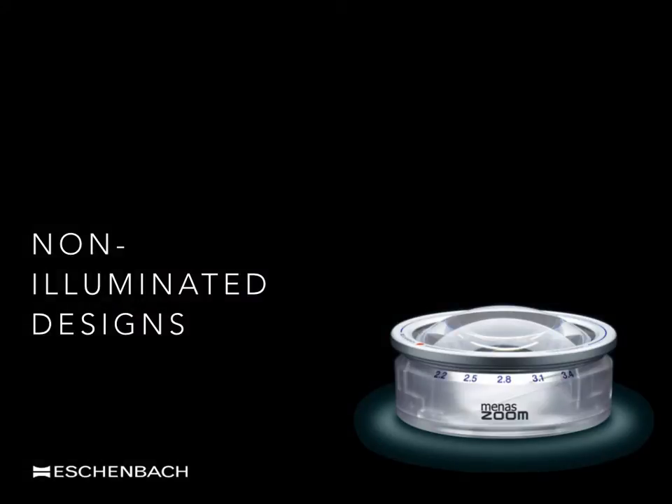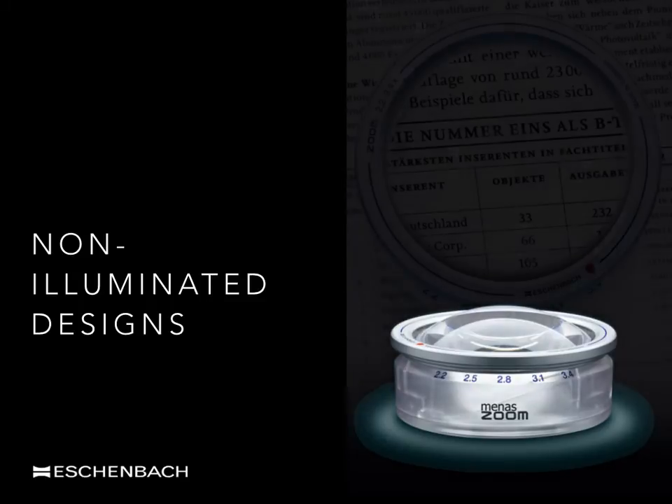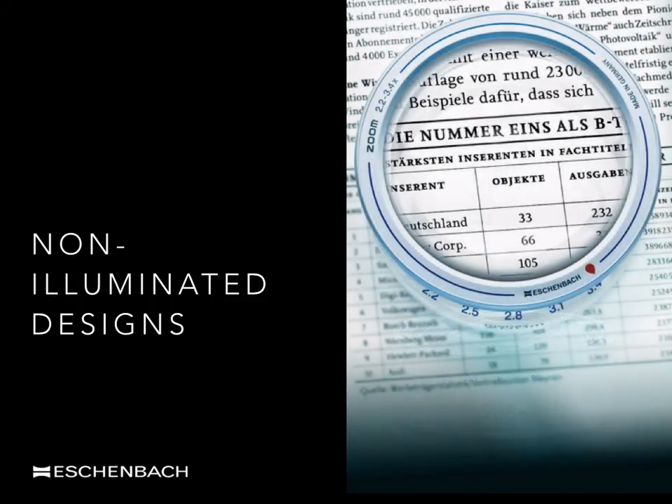Not all designs incorporate light. Removing integral lighting in a design will significantly reduce both the weight and portability of the device. The Menas Zoom has a double lens system which, with an anti-clockwise twist of the casing, can increase the magnification of the device from 2.2 to 3.4 times magnification. The clear plastic casing allows light to fall onto the page from all directions.